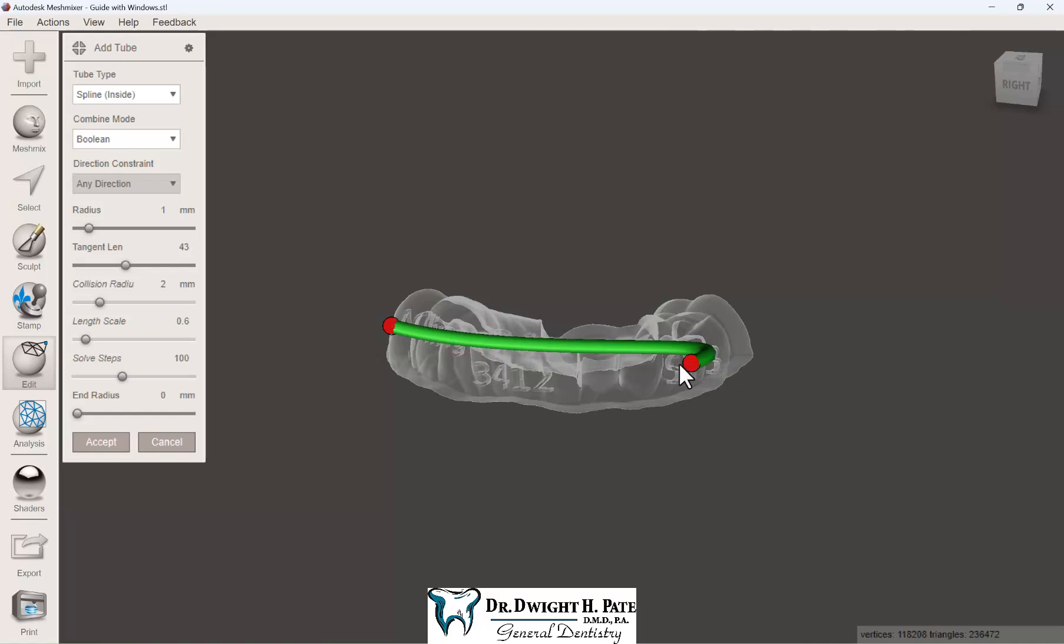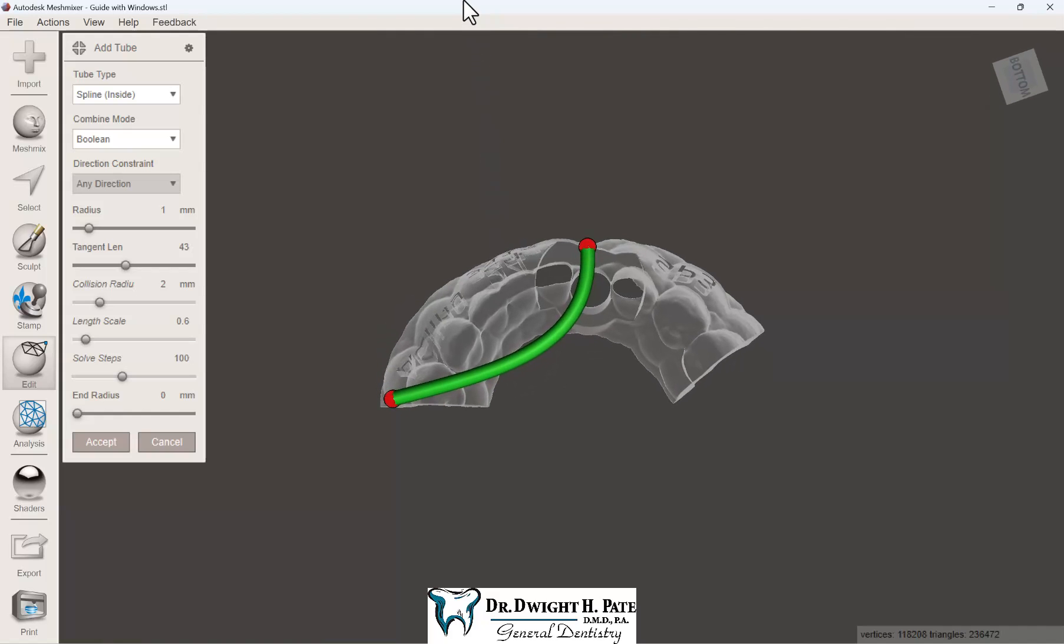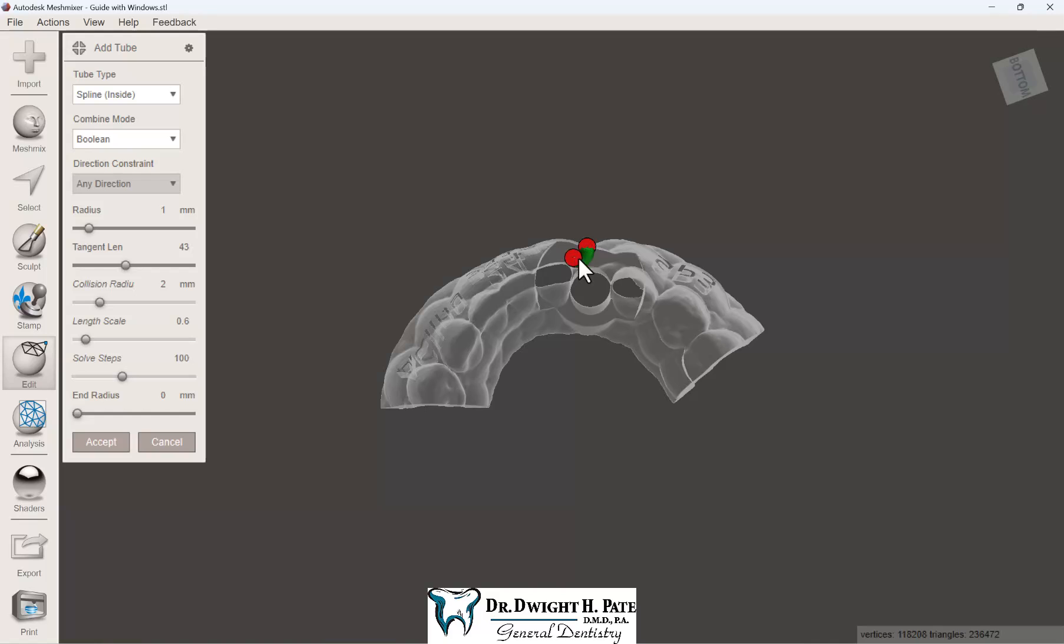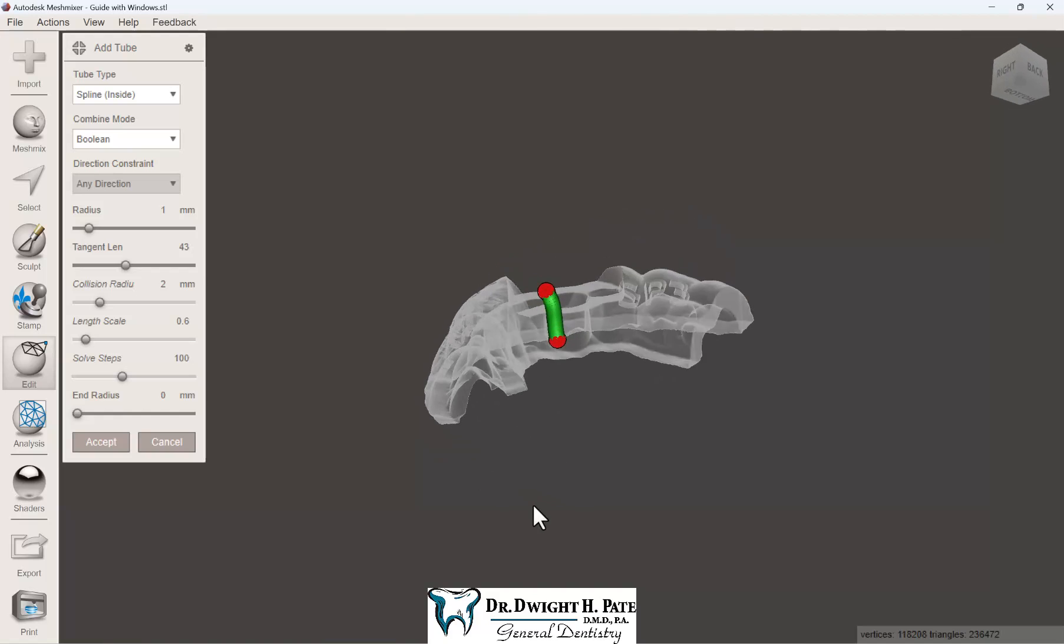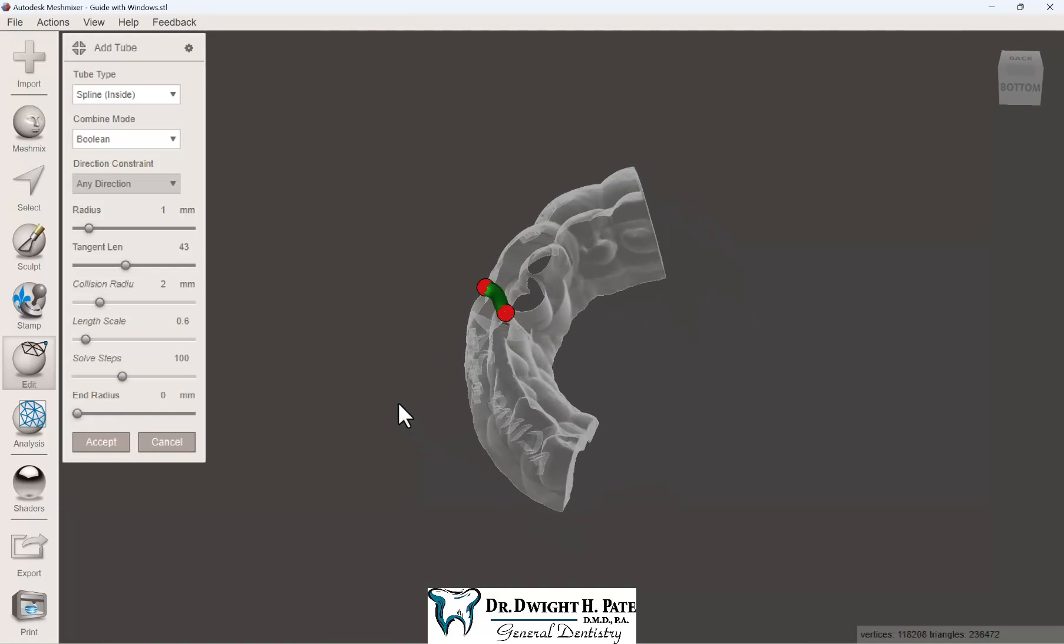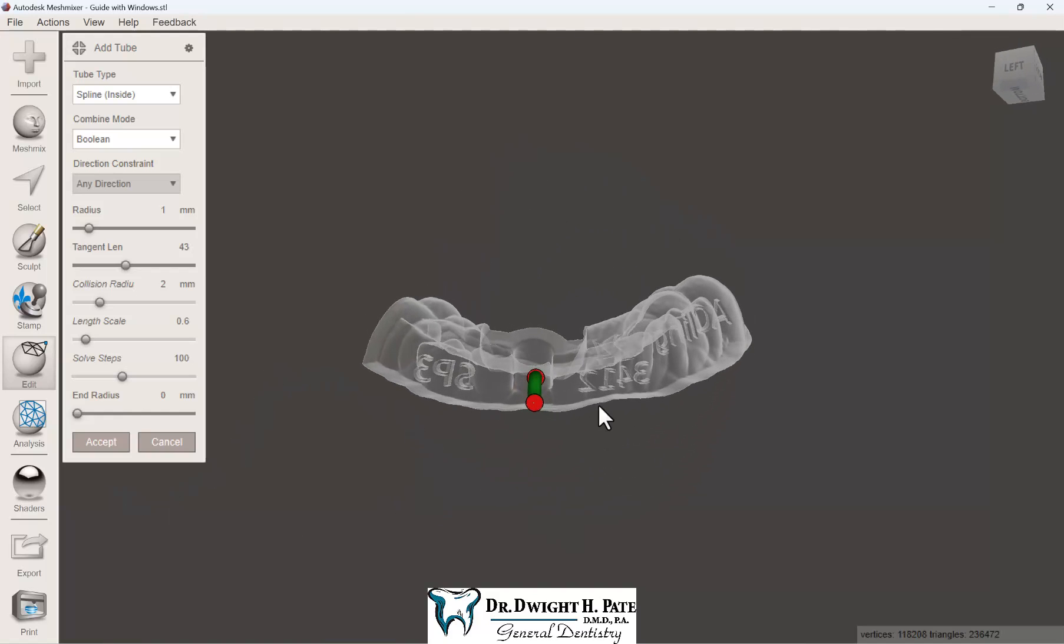The radius I like to use is 1mm, which will create a 2mm channel. Position the little red nodes on the outside and inside, right where the bottom of the sleeve is. Just do your best with positioning.